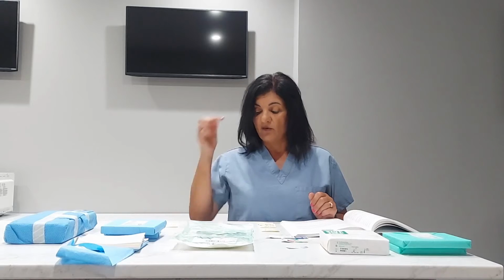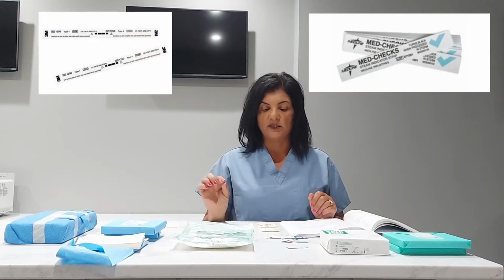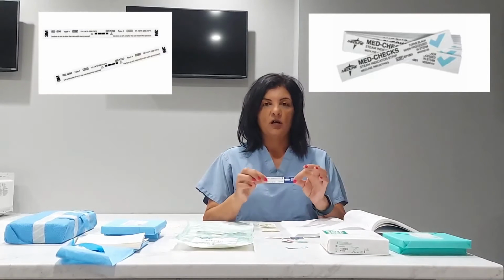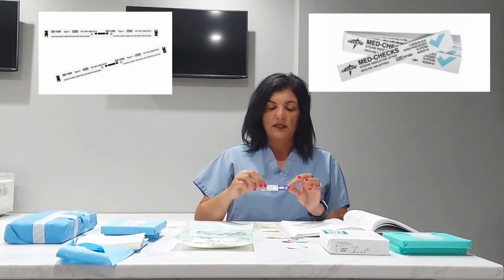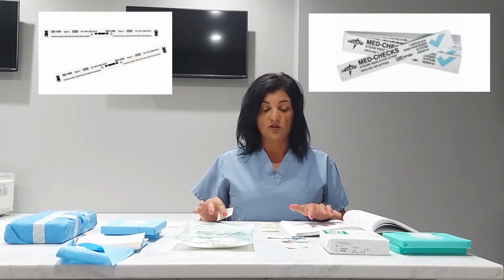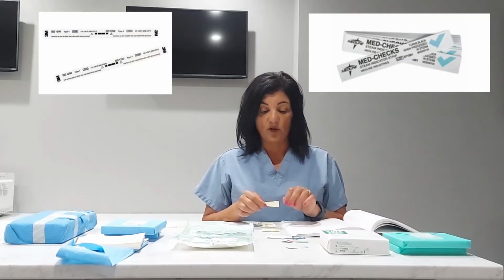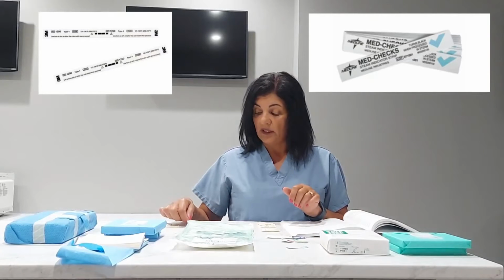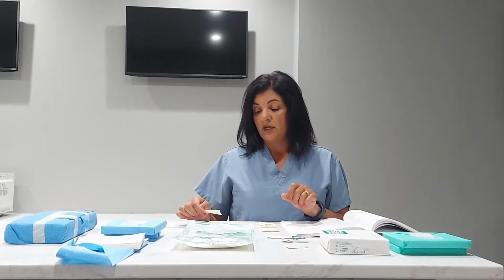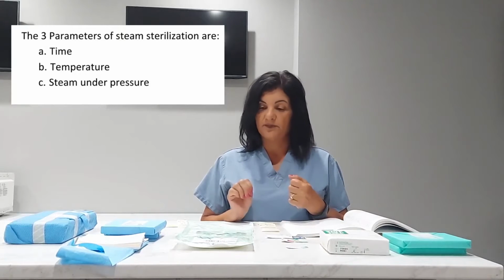Same thing with the class type 4. I do not have an example. I will post a picture of it. Typically the ones I've seen are kind of long like this, more of a paper, and those can be used in some sterilization cycles. Just make sure you look at your IFU and see that it's validated for a class 4 chemical indicator, because the class 4 is designed to react to 2 or more of the parameters of steam sterilization. And again, the parameters are time, temperature, steam under pressure.